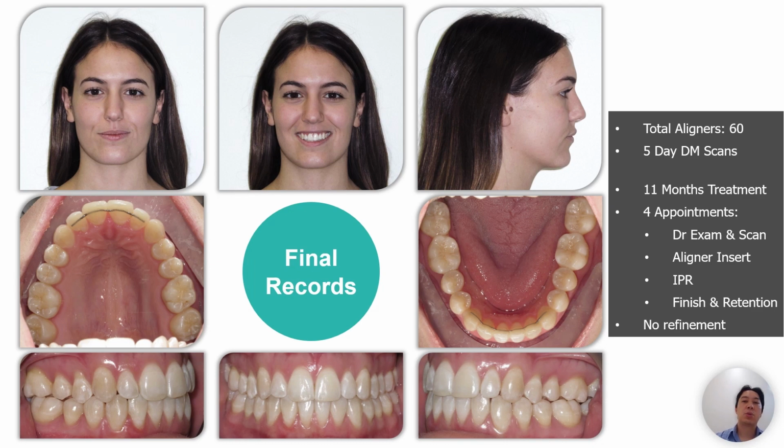Total aligners were 60 aligners. She was doing scans at 5-day intervals. Overall, about 11 months, and 4 appointments essentially.